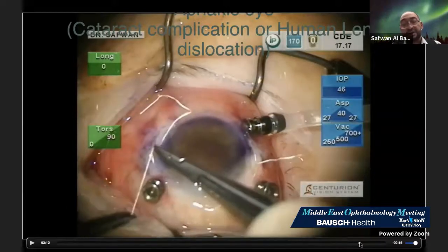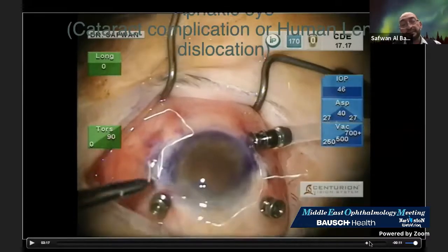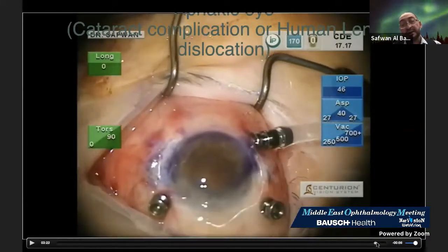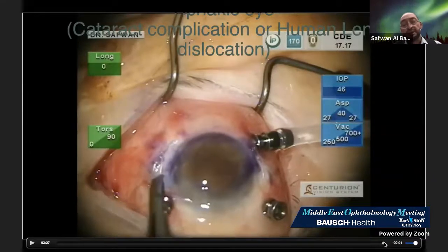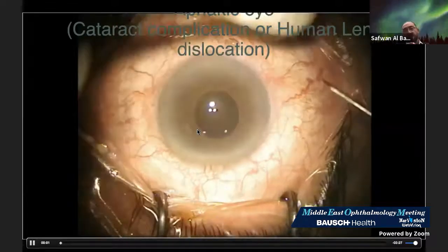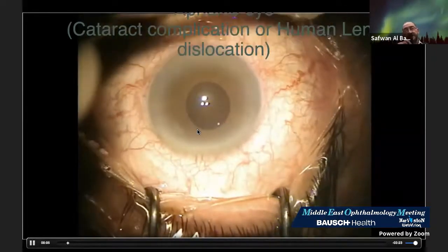So I can finish here tying, then cut all the sutures, trim them, bury them, and then close the conjunctiva. Now, I think I have the right to return it back, and it will be a very quick movie. And you can see the tips that I mentioned.